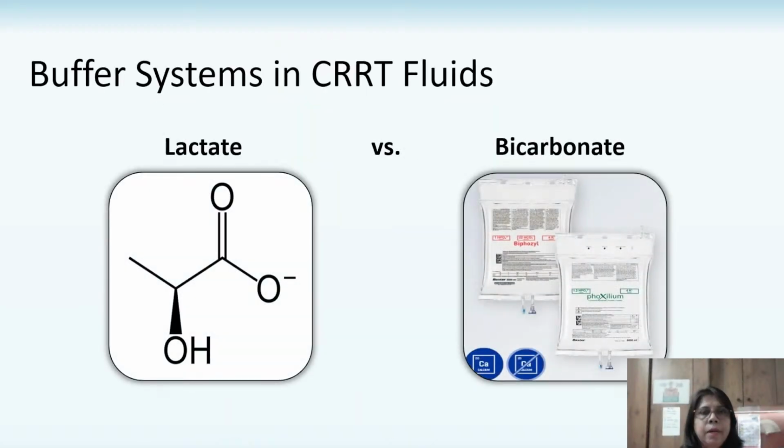Both lactate and bicarbonate have been used as buffers in dialysate fluids and CRRT replacement fluids. Historically, lactate was preferred over bicarbonate fluids because of the instability of bicarbonate fluids, especially in gas-permeable plastic bags stored over prolonged periods of time. Controlled trials have shown that both lactate and bicarbonate are equally efficacious in dealing with metabolic acidosis during CRRT. However, recent studies have shown that bicarbonate has more efficacy in dealing with metabolic acidosis as compared to lactate.